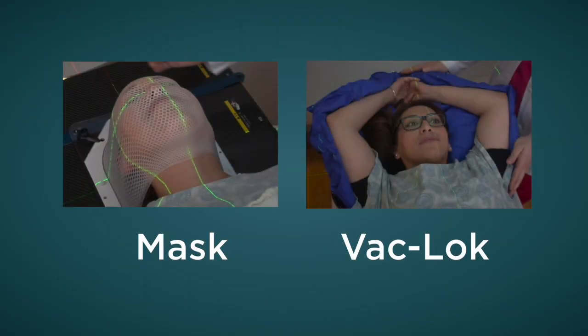We begin the simulation by creating an immobilization device. We will use this device throughout the entire duration of your treatment to help hold you in the same position each time you receive treatment. We typically use either a mask or a vac lock.